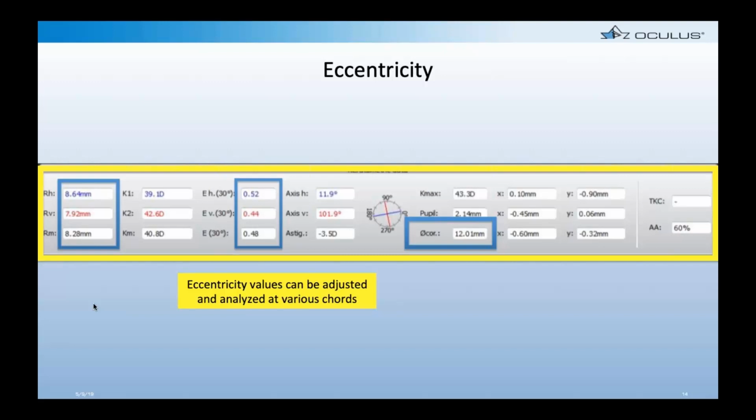We use corneal diameter a lot. Corneal diameter is, if anything, becoming a more utilized measurement for whether it's scleral lenses or ortho-K. Many ortho-K lenses now, the labs want corneal diameter information because they have a set diameter for the lens in mind, and it's corneal diameter minus a millimeter or corneal diameter minus 0.6 of a millimeter. For that design to work optimally, they really want to know the corneal diameter. And that data is printed out immediately on your basic display with the keratograph.